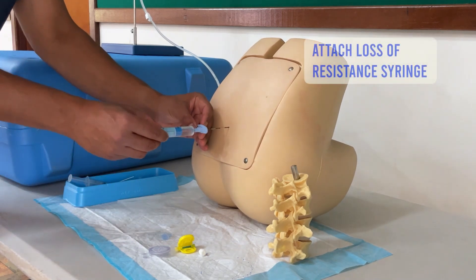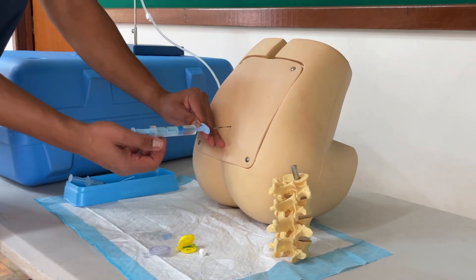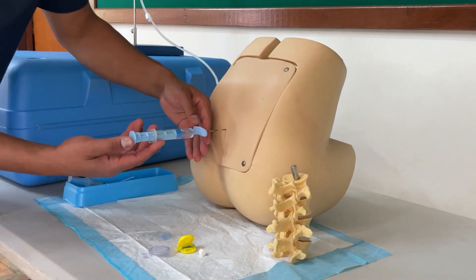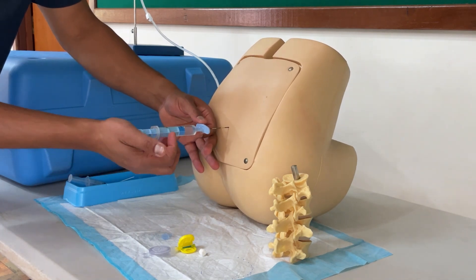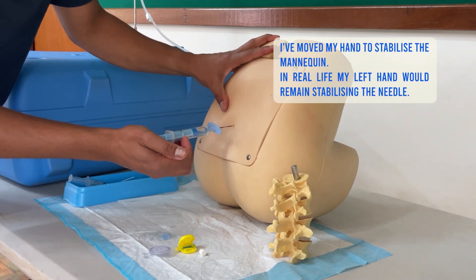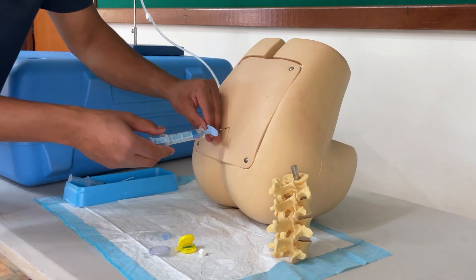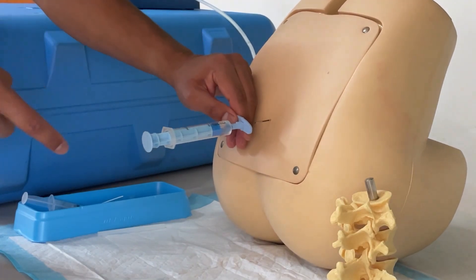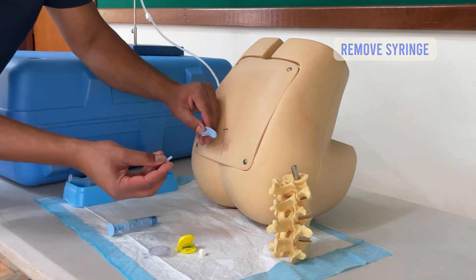I then apply my syringe to the end. There are a few different techniques — often people push with one hand while applying constant pressure. I find a simpler technique is to hold and balance the epidural needle with one hand and apply pressure very gradually with the other. Once I get loss of resistance, I'm in the epidural space. I then look at my needle to find exactly where I am — I'm at about 4.8 to 5 cm. I take the syringe off and I'm ready to thread the catheter.